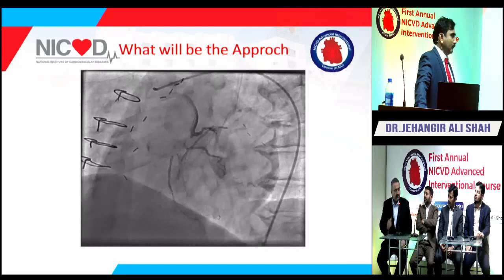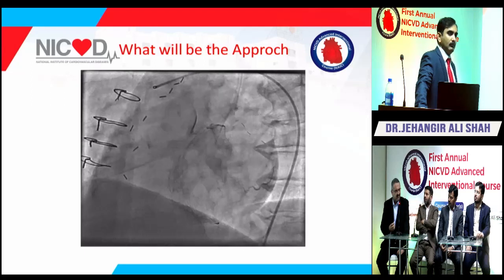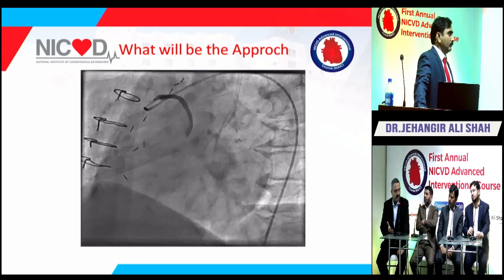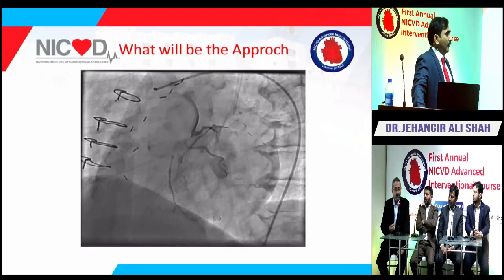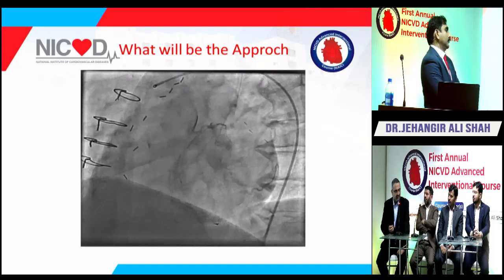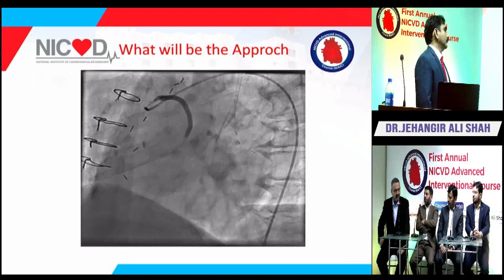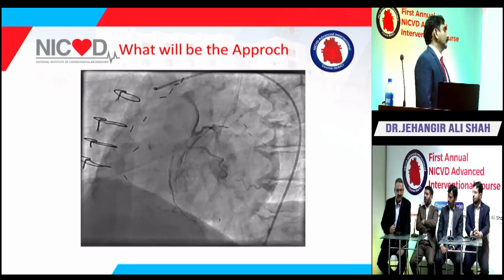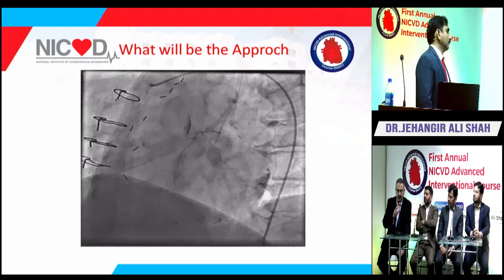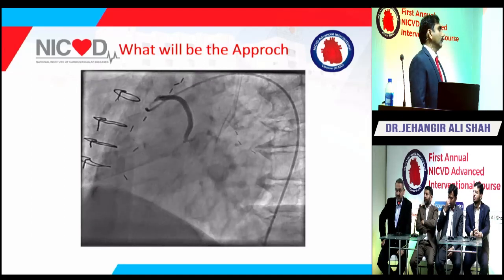However, you really do not need an extra backup support guide, except in cases where there are more distal lesions. In such cases, you may need an extra backup guide, or if you want to put in embolic protection devices, where anticipated challenges have to be faced because of the distal protection devices. In such cases, you can have an extra backup support, but especially in your case you really do not need extra backup support, because in aorto-ostial lesions you don't need good support, as there was already dampening of the pressures while you were engaging with the diagnostic catheters as well.